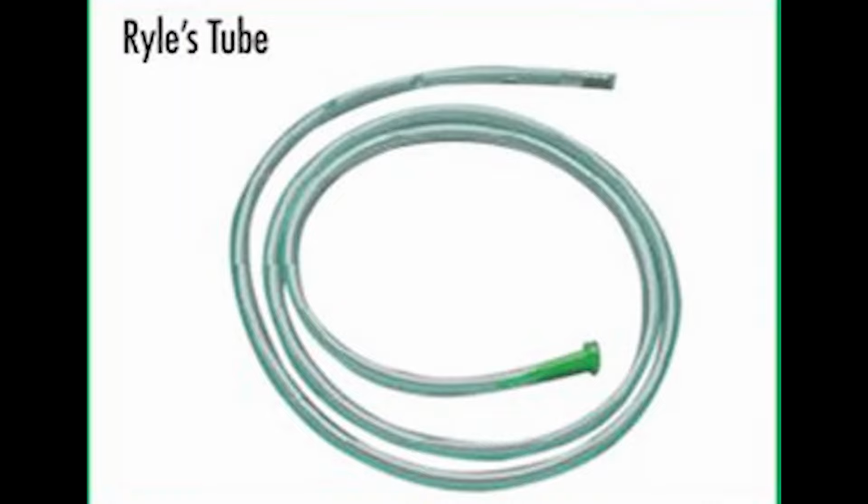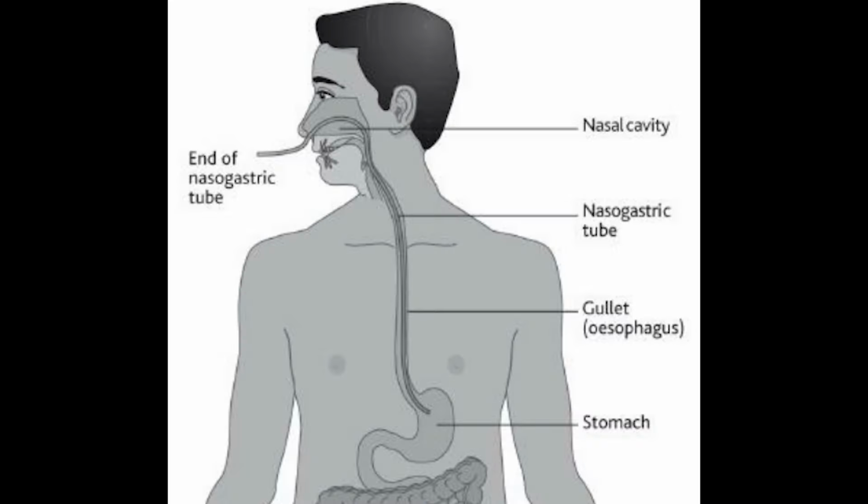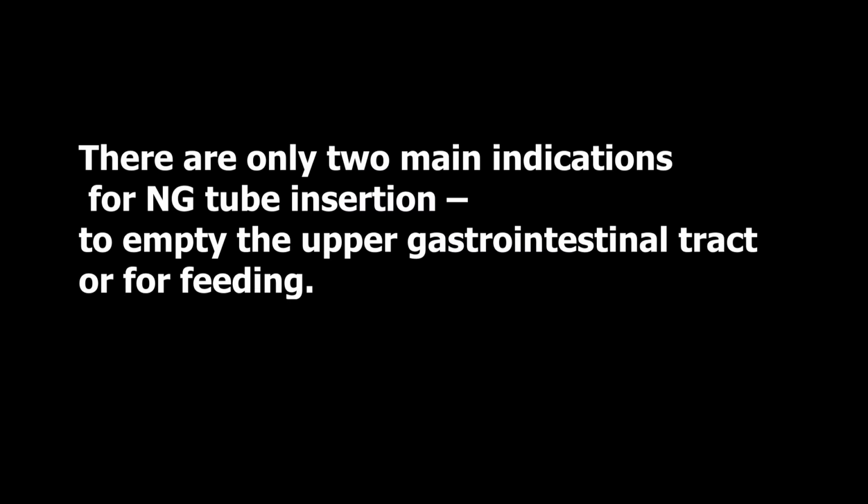In this video we will learn about the insertion of the Ryles tube, aka the nasogastric tube. It's a long polyurethane or silicone tube that is passed through the nasal passage via the esophagus into the stomach, and they are commonly inserted in surgical practice for various reasons. There are mainly two indications for nasogastric tube insertion. First is to empty the upper gastrointestinal tract, or for feeding.